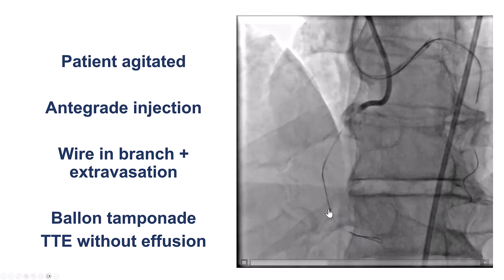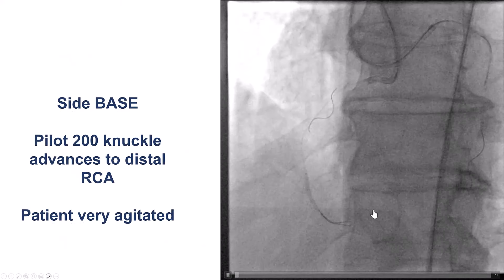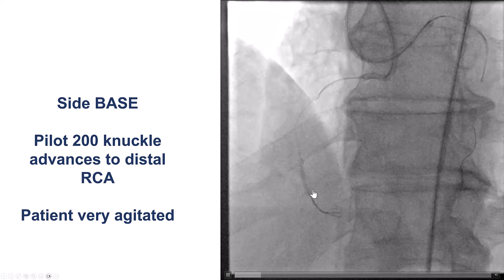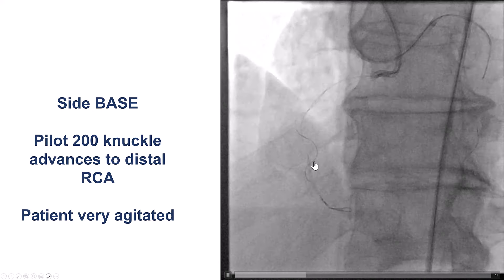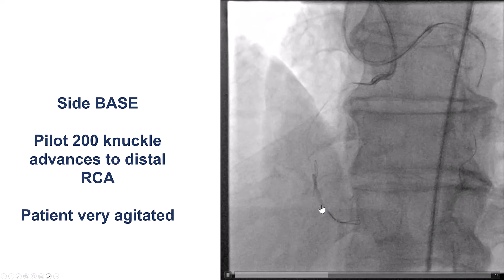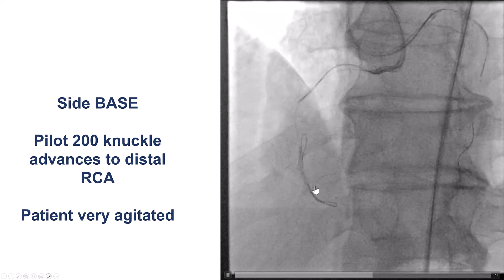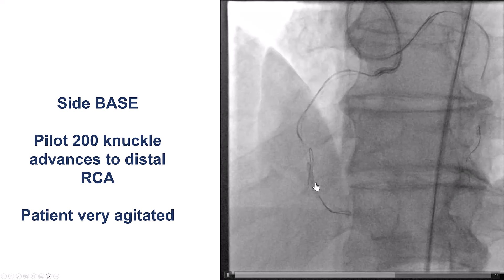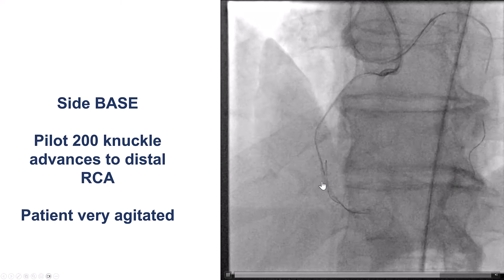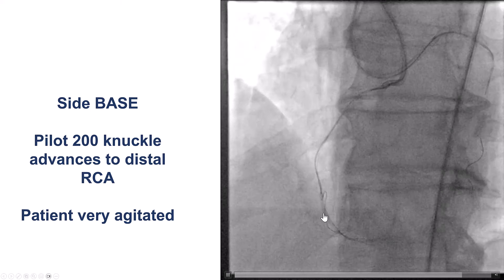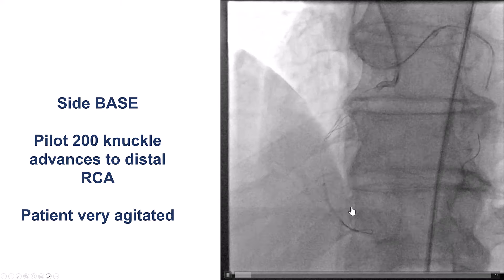We inserted a small balloon and did an echo that did not show a pericardial effusion. Then to avoid getting into this branch, we used the side-BASE technique with a balloon halfway in the distal RCA and halfway into that acute marginal branch. After doing that and using a Pilot 200 guidewire, the wire was able to knuckle and eventually cross in a different plane going towards the distal RCA.